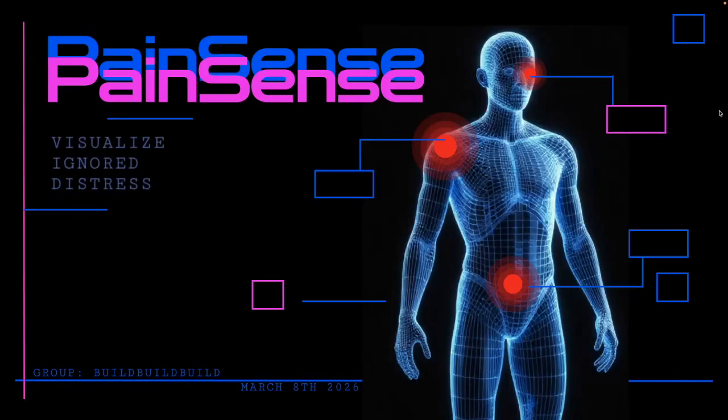Hello, everyone. Today, we'd like to introduce PainSense, a system that helps visualize one of the most difficult medical experiences to communicate: pain. Pain is highly subjective. In many clinical situations, patients are asked to describe their pain using a simple scale from 1 to 10, but numbers alone cannot capture where pain occurs, how it evolves, or how it connects to the body condition. So PainSense aims to transform pain from an invisible feeling into something that both patients and doctors can see, track, and understand together.